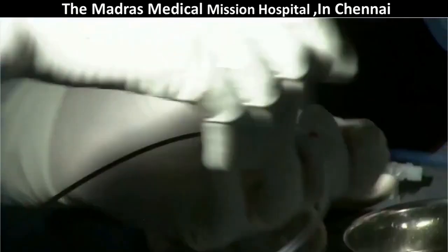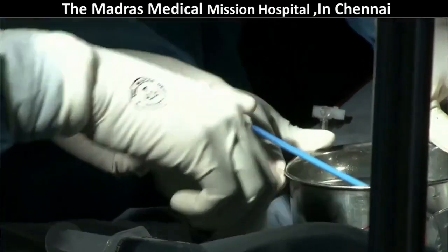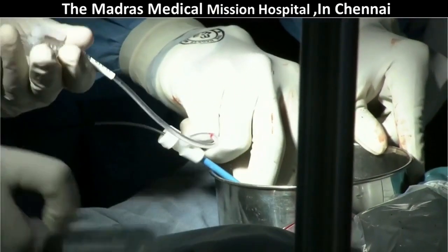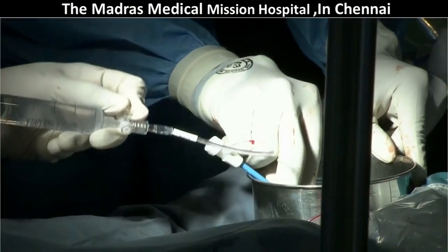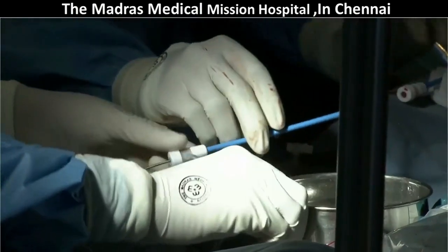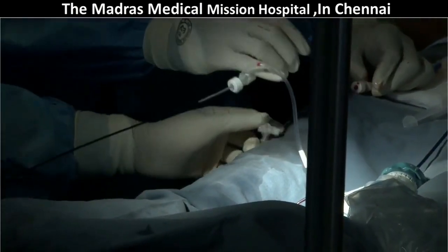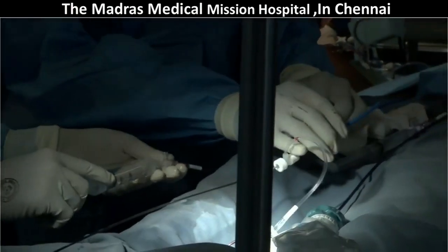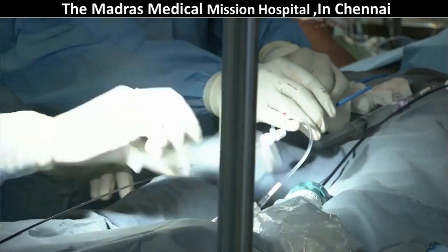So right now we are de-airing the system, putting it underwater, and we are expelling the air from the device. I'll flush the left atrial sheath also now.